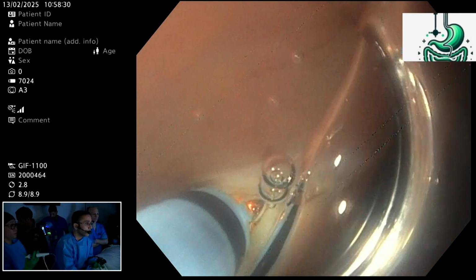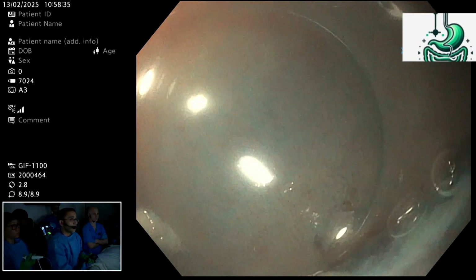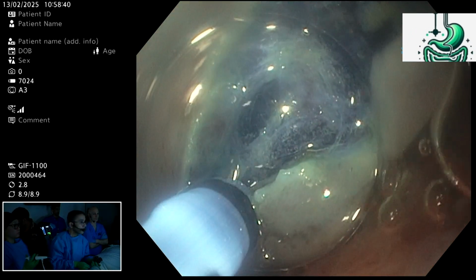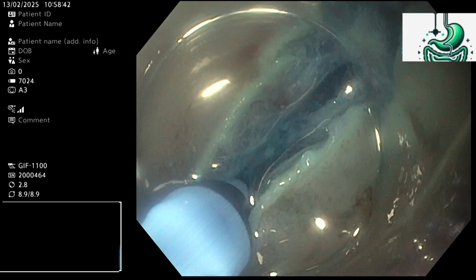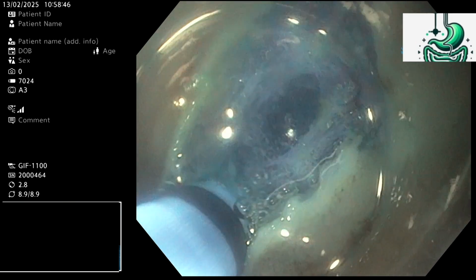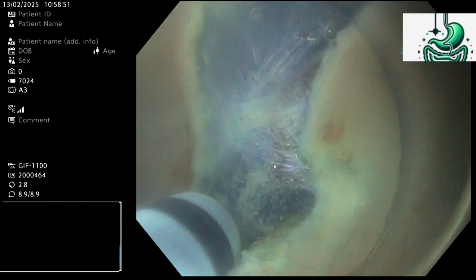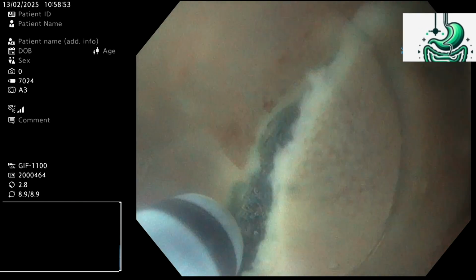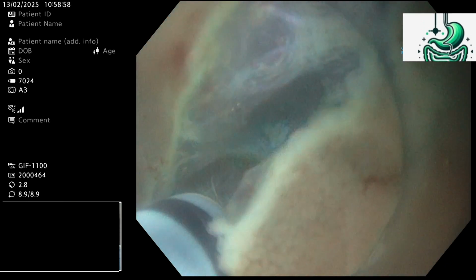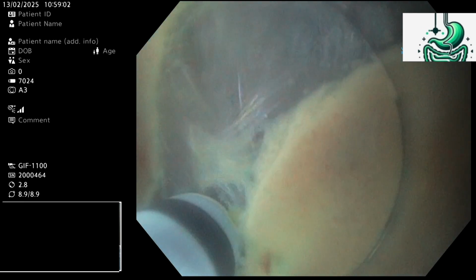So it's a matter of strategy, as you say, but here also we will try to make like a 90-degree rotation. We'll not do a circumferential incision. As you will see, we may be able to have also a good stable strategy here, but with a wide incision. But why not the pocket creation method here? Yeah, still we can use it. But why did you choose this? I'm asking you why you chose this over the pocket creation. Yes, because I am more familiar with this, and I believe the most important thing is to have a strategy for a stable location.